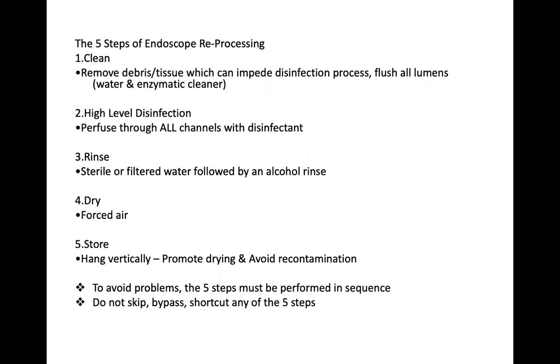So for example, an endoscope is just one example of an item that can be reused and therefore would need processing. One, you clean it using an enzymatic detergent. Then you disinfect it using a high-level disinfectant. Remember, an endoscope gets into contact with the mucous membrane, and that has the semi-critical classification according to Spalding. So if you could sterilize this, very well. But if you cannot, use a high-level disinfectant.